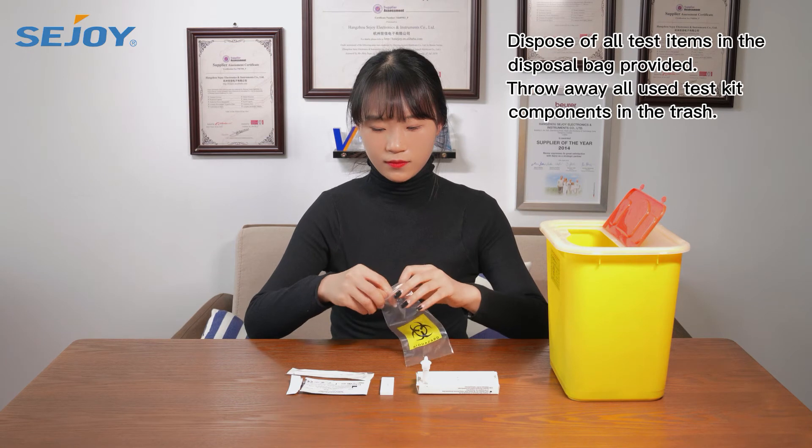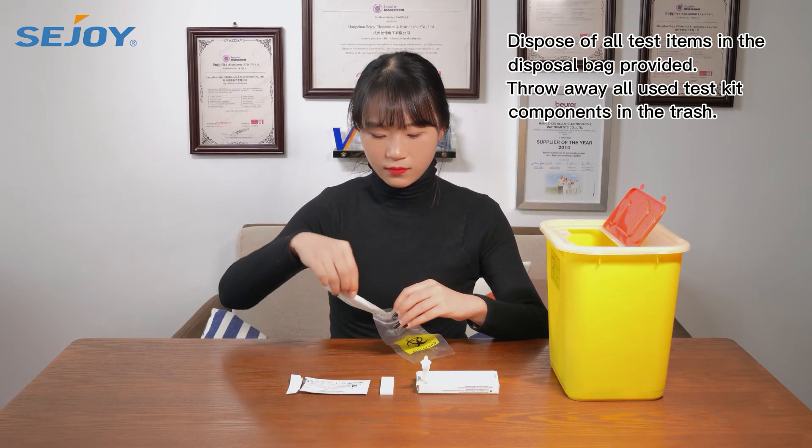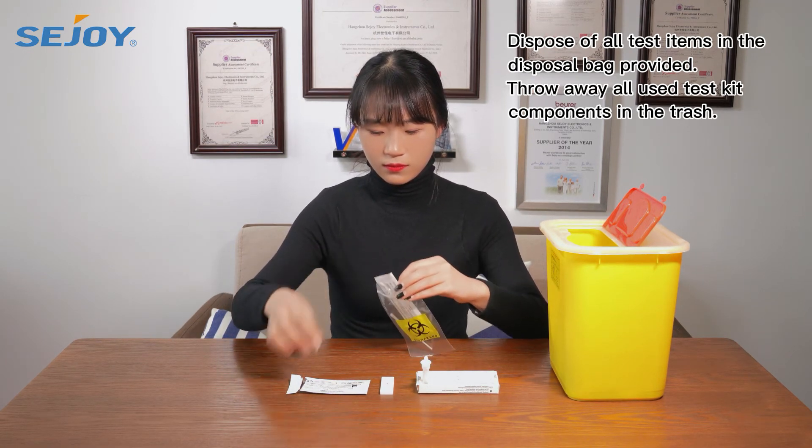Dispose of all test items in the disposal bag provided. Throw away all used test kit components in the trash.